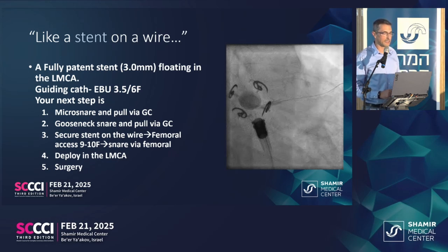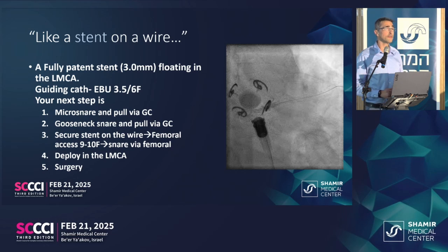So this is where the stent is, at the edge of the catheter, sitting there, floating, mocking me. And this is where I ask you, what's the best way to manage this case?